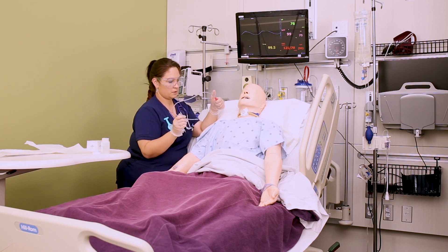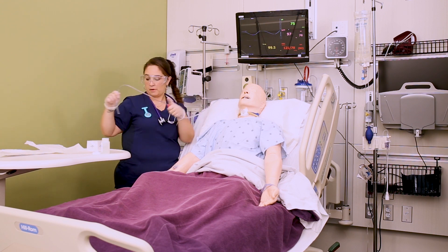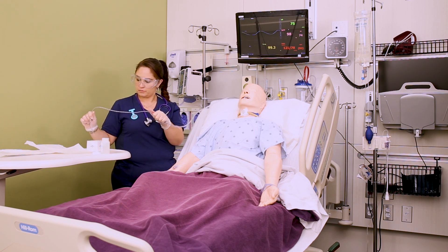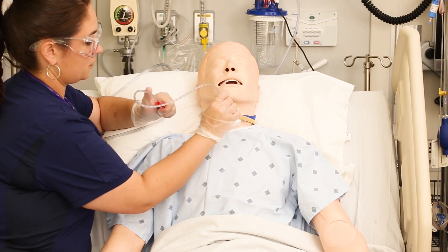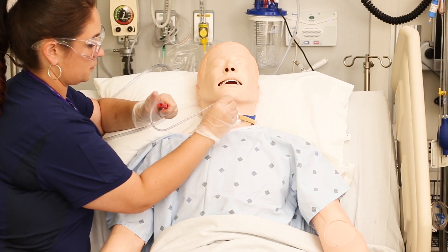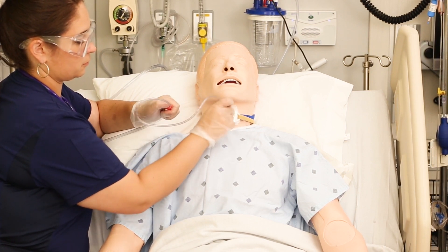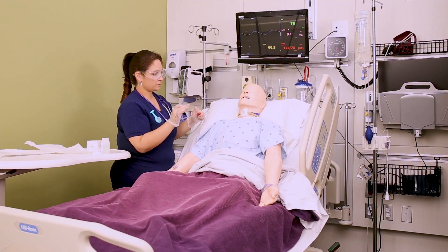Once you're out, hold that catheter away from the patient to keep it sterile, replace their oxygen source with your non-dominant hand if you need to, and decide whether or not you think they need another pass. If the secretions were super thick you can suction some of that sterile water through the catheter to clean it out. You can do up to three passes with one catheter but no more than 10 seconds per pass. Again insert the catheter and remove while applying intermittent suction and twisting the catheter — this helps ensure you get all the secretions off the edge.